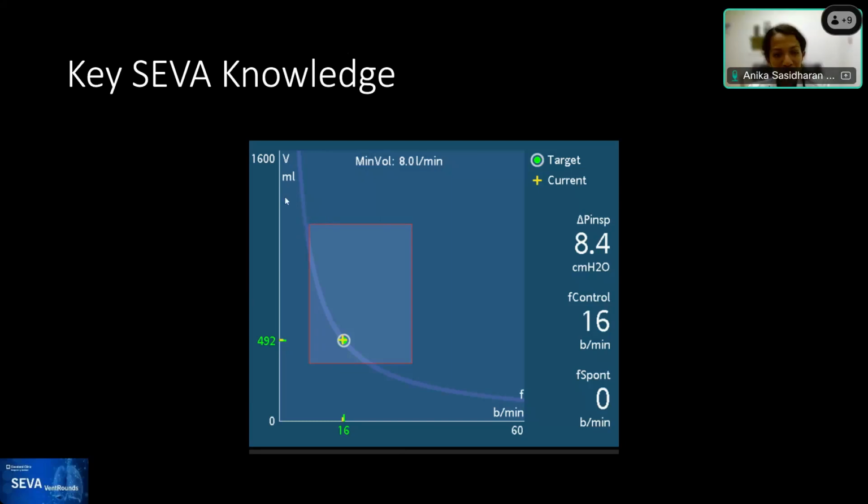Okay. So basically, ASV uses a targeting scheme that we call OI, which is optimal and intelligent. Does anyone want to comment on what these two targeting schemes do? What does optimal do and what does intelligent do? And then Rob, you'll have to tell me if anything comes up in the chat. Yeah, I'm looking. Okay. If not, we can just talk about this.